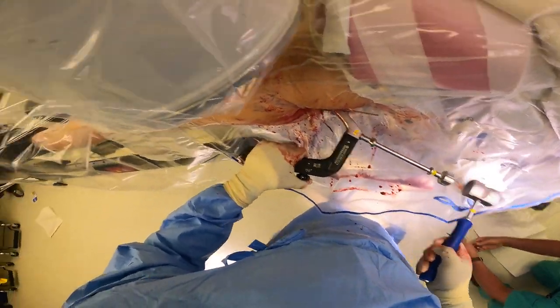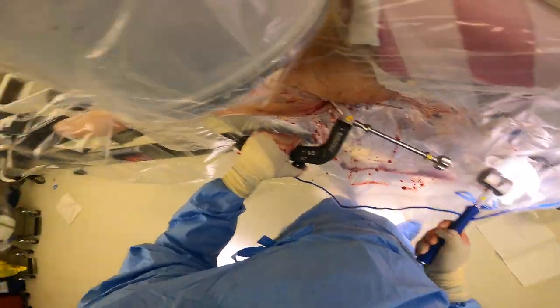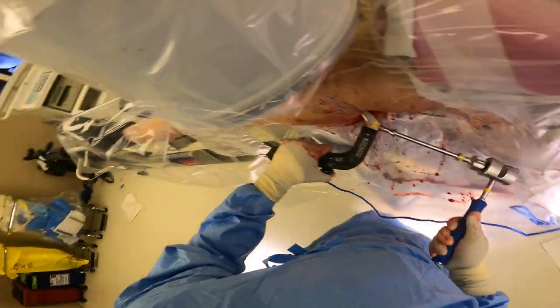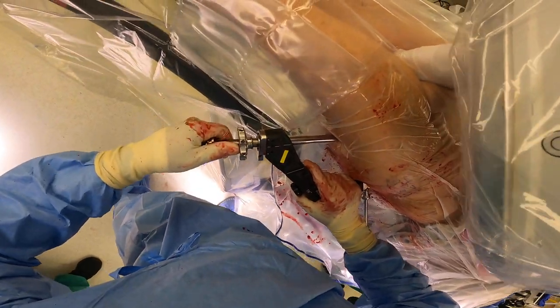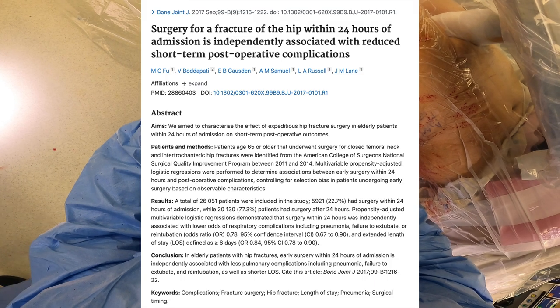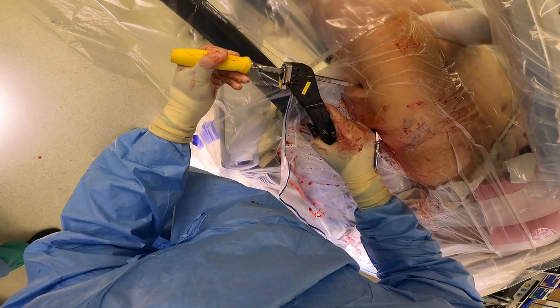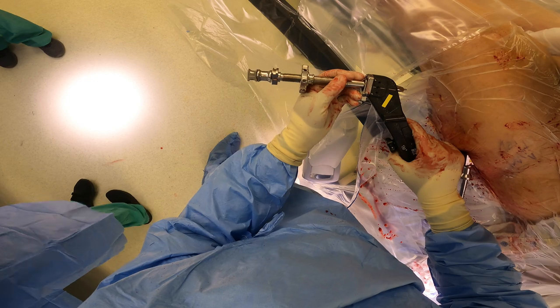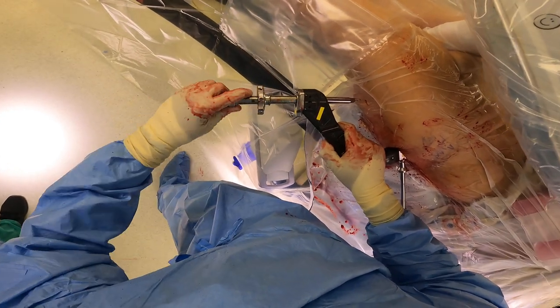This titanium rod goes on the inside of the bone to stabilize the fracture. We generally do these fractures with a goal of less than 24 hours — so if a patient falls and breaks their hip, within 24 hours is within the standard of care. We do these surgeries within 24 hours typically to get the patients up and start weight-bearing, which means walking. The longer that the patient lays in bed or surgery is delayed, the more likely the patient has a risk for post-operative complications. With these hip fractures, their mortality rate goes up. If surgery is delayed, patients have increased risk of bed sores, DVTs, and post-operative complications, so I try to get to them within 24 hours of getting called from the ER.